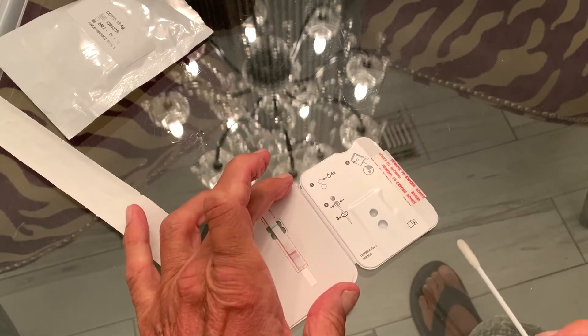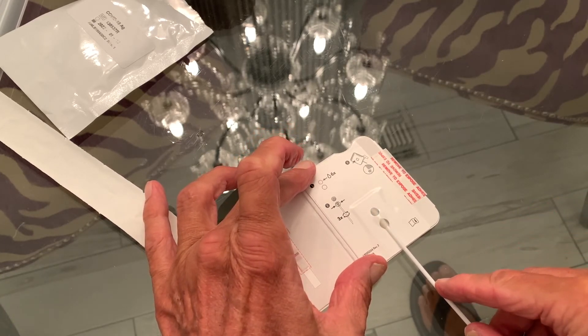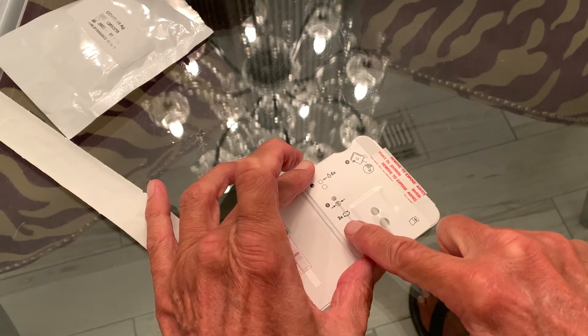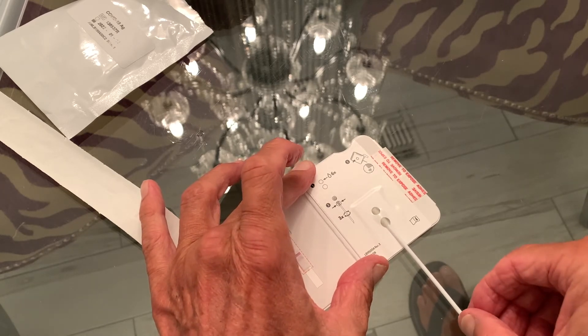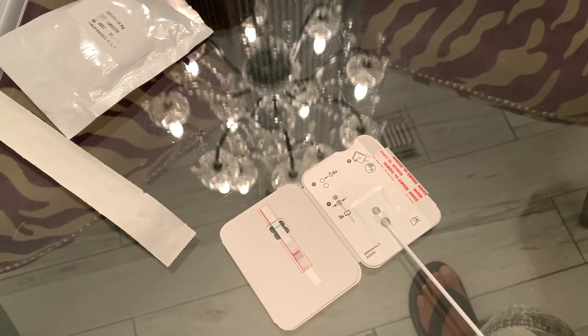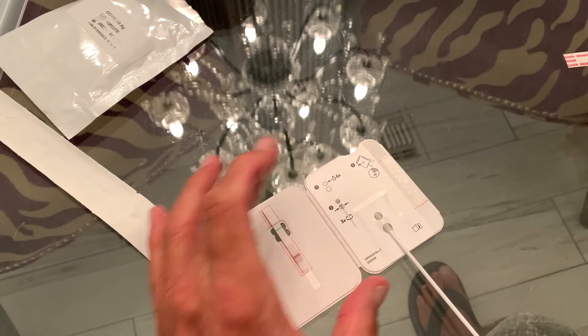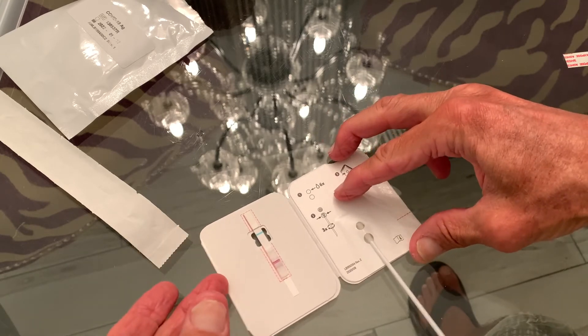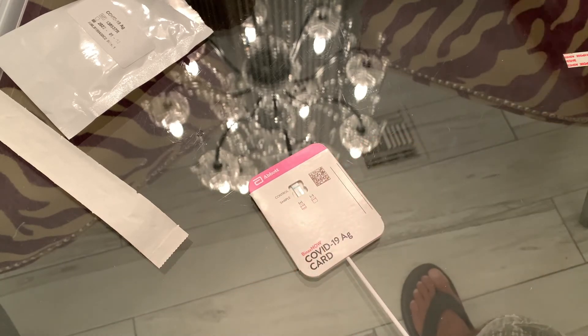Now you've got to stick the swab underneath here like this. Push it under and once you get it up in position, you're going to rotate it. It shows you to rotate it three times: one, two, three — so it's getting all the sample into the reagent. Then pull the adhesive off; there's our blue control line. Flip it over and push it down.